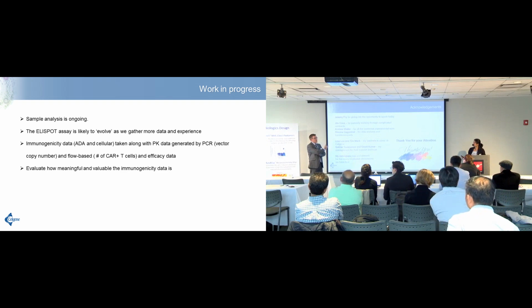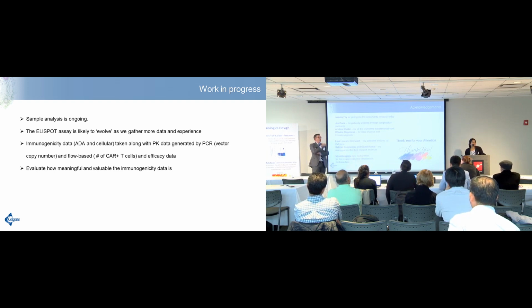So at the moment with the healthy validated controls, we could have set that way higher. But I think there's that question, as we discussed, that we didn't want to eliminate any of those patient samples on that basis automatically. Otherwise there may be an issue that none of those patients could then be analysed at all because we had that set. But yeah, in reality it's a lot higher than that.